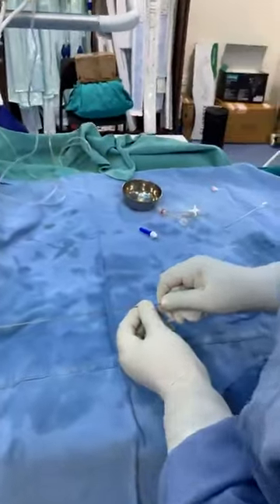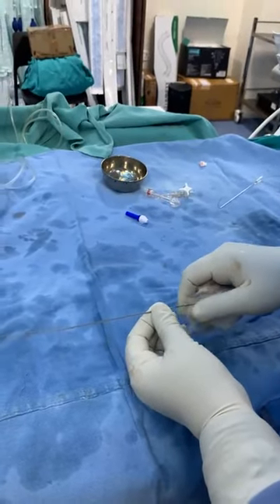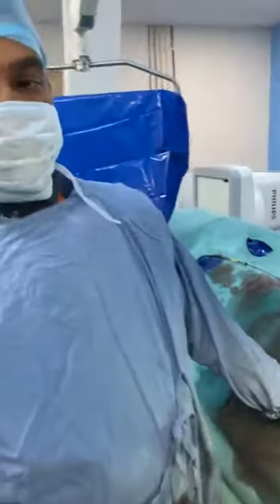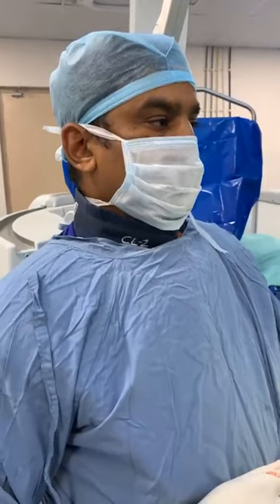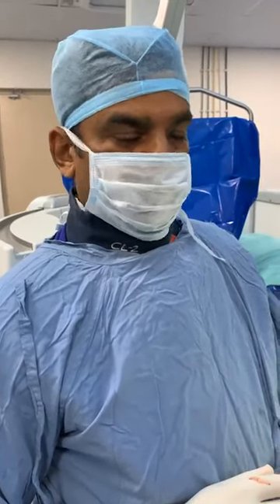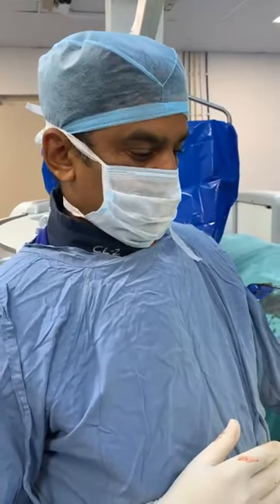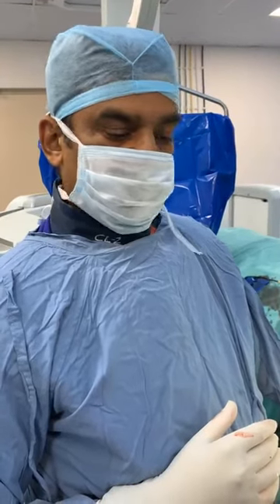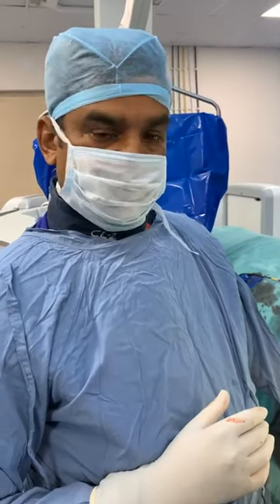Go. So now we are taking this flow diverter into the delivery catheter. Smooth. So we should ensure that everything is going smoothly with minimum friction. And if you have friction, you have to stop. You have to look at what is happening. You look at the fluid that is running, and the size of the catheter that you will use compared to the size of the device you're taking, because they are compatible with 17, 21, and 27 catheters.